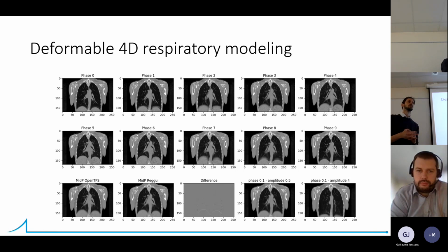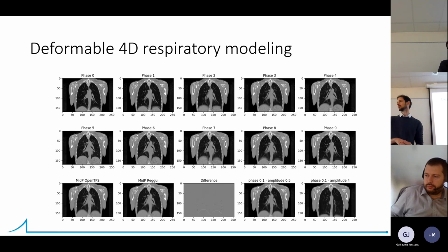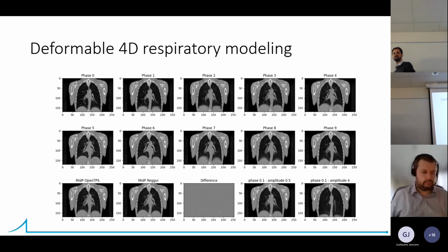I think it's serialized. Yes. So if you always use the same model, you can save it as a serialized object. And this one we will be able to reload after. Yeah, so you just export the binary version of what you have in OpenTPS. Okay, thank you.